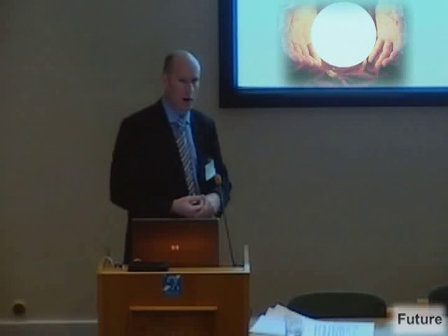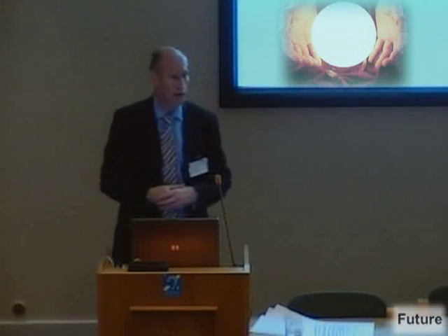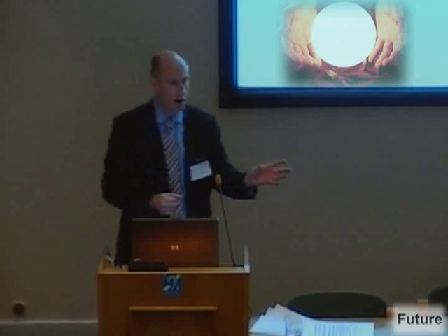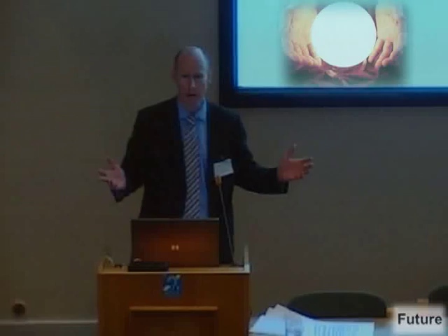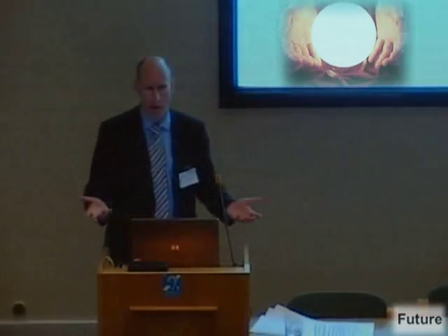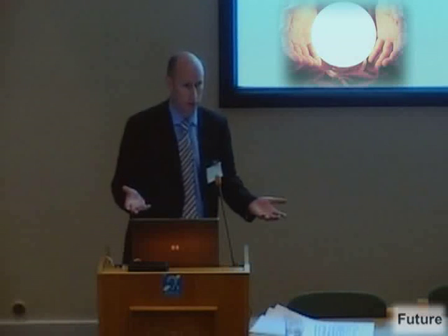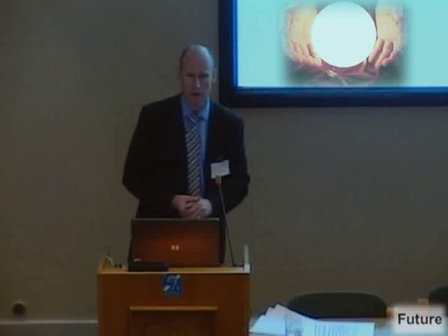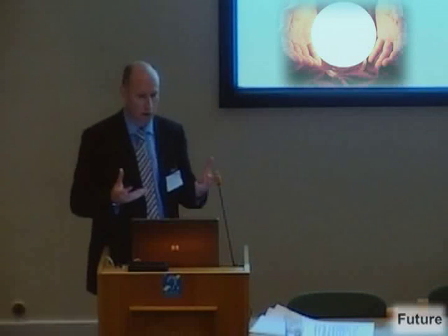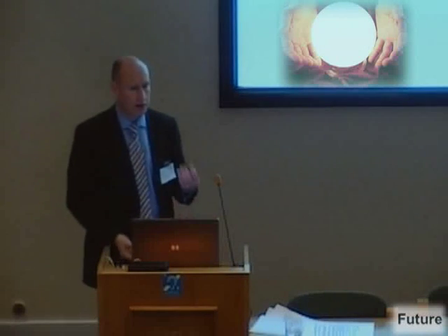So years ago you may have had a 1.5 Tesla magnet which may have had a room full of cabinets. You now got that same 1.5 Tesla magnet, but the cabinets could go in a corridor or in a very small cupboard. Likewise with a biplane system. We used to have huge computer rooms to run a biplane system. Now we could be down to 3 or 4 cabinets, which is very, very small. So my answer is no, the equipment is not getting smaller, it's getting more powerful.